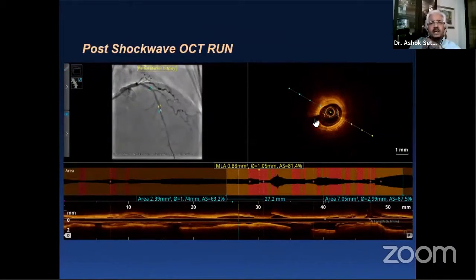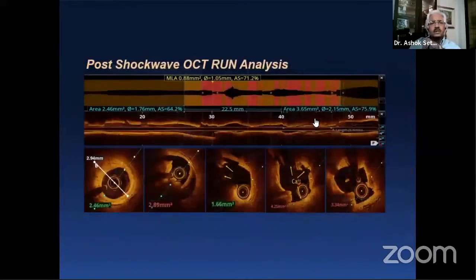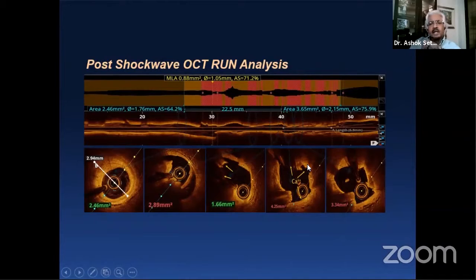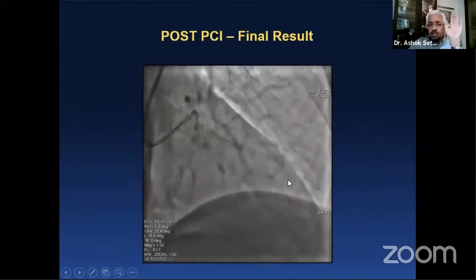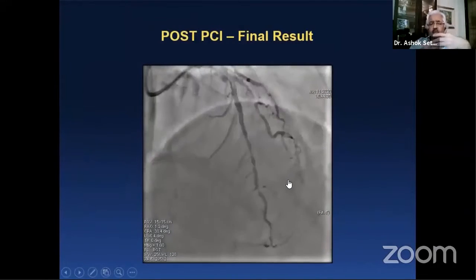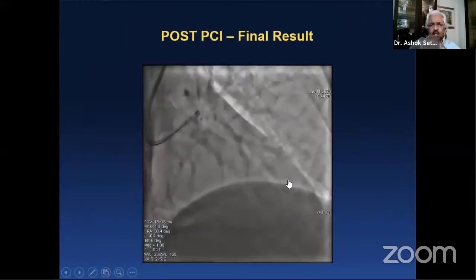This is the post-shock wave run. What is nice is that you see these cracks and fissures at multiple points going up to the media and into the calcification. This is a lovely one which has gone right nicely into the calcification — so numerous cracks and fissures as you crack it at low pressures, four atmospheres, and once you've opened it up you go up to six.